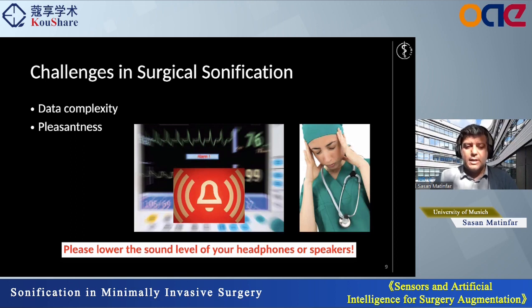So we know that auditory feedback has advantages, but it also has challenges, especially in medical, where we have very complex data. We have high-dimensional and huge amounts of data that we want to provide so that surgeons don't miss them intraoperatively. But at the same time, when we want to sonify all these information channels through sound, that would also be challenging in terms of usability, intuitiveness, and also the pleasantness of the sound.